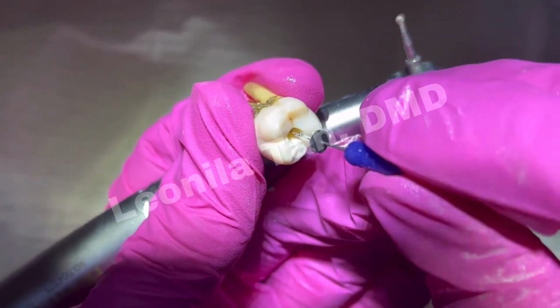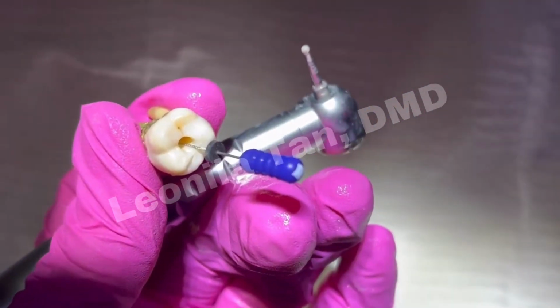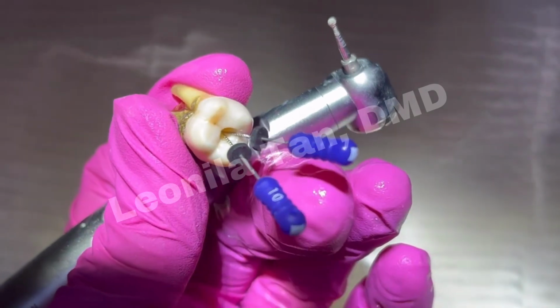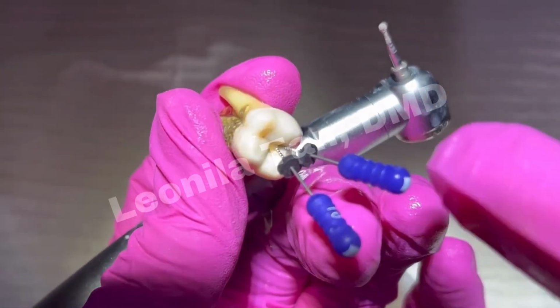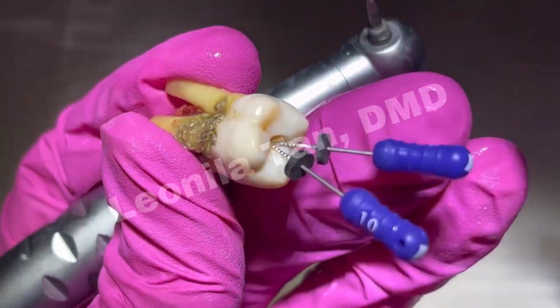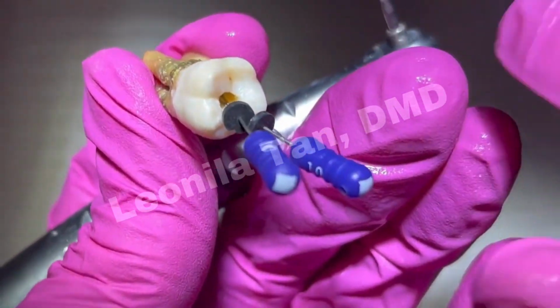So we've located a canal there on the buccal side, and let's just check. This one goes to the palatal side. So now you have located two canals, the palatal and, basing on the direction, it wants to go to the distal, so you have your distobuccal canal.